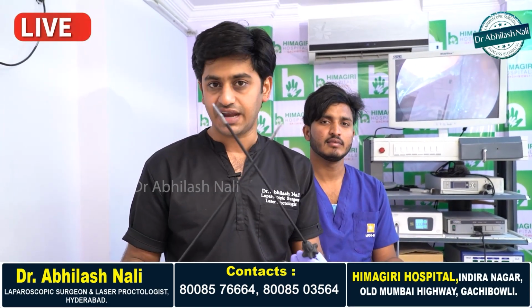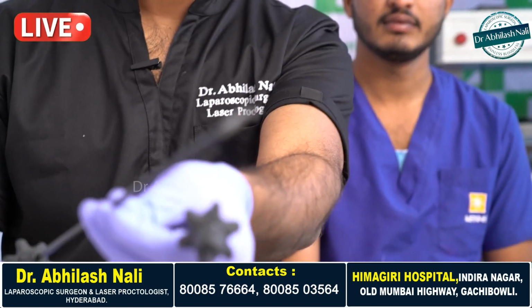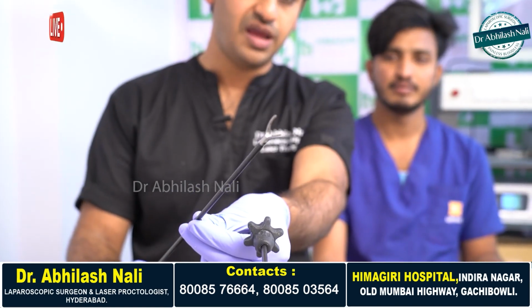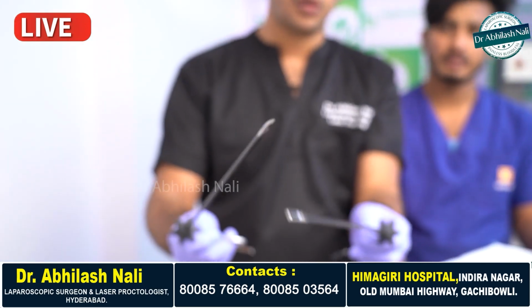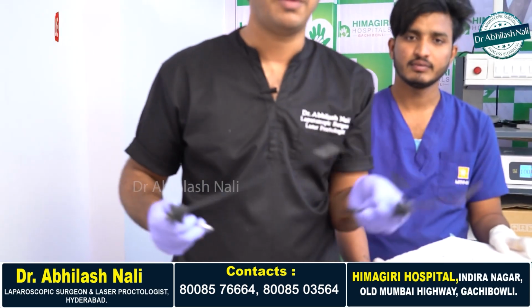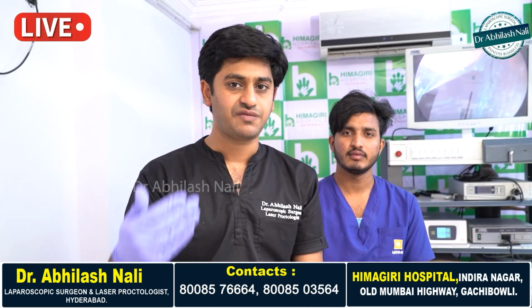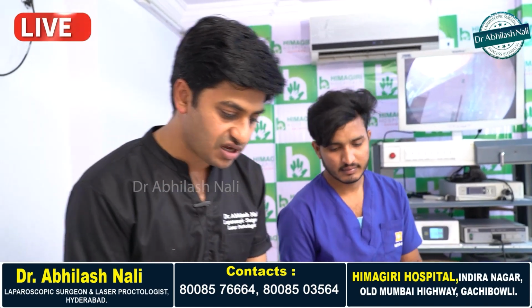How these laparoscopic instruments help, we can see. Just like a human hand, with these laparoscopic instruments we are able to open, catch, close, and lift it up, and we will be able to remove it. Likewise, we have many laparoscopic instruments even for suturing, cutting, etc., and to control blood loss.